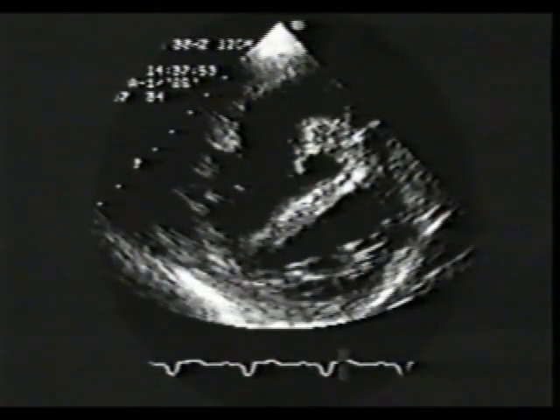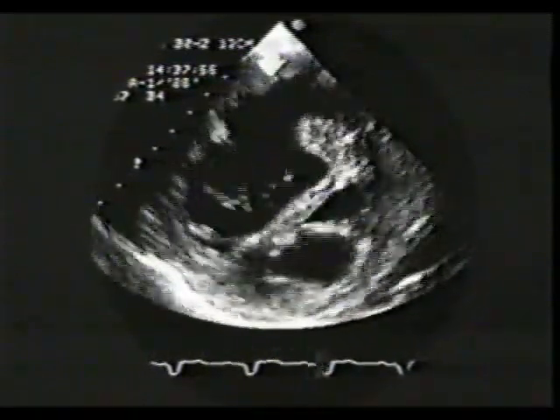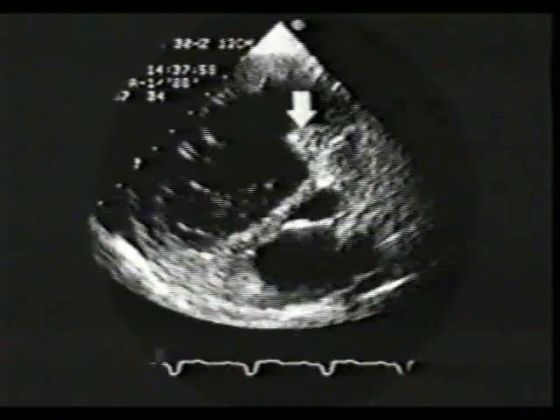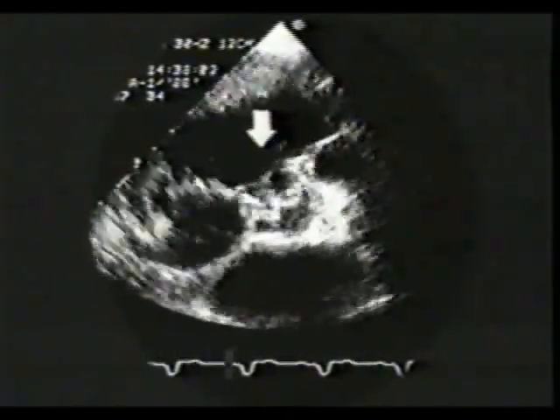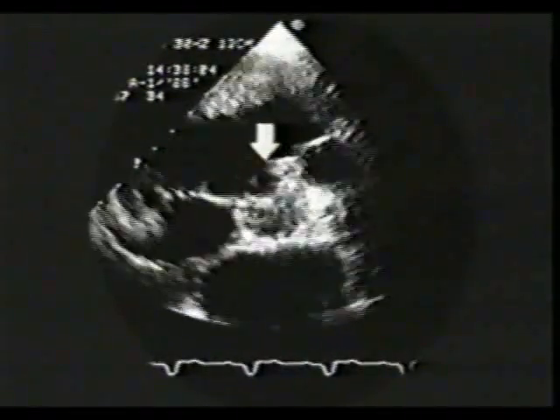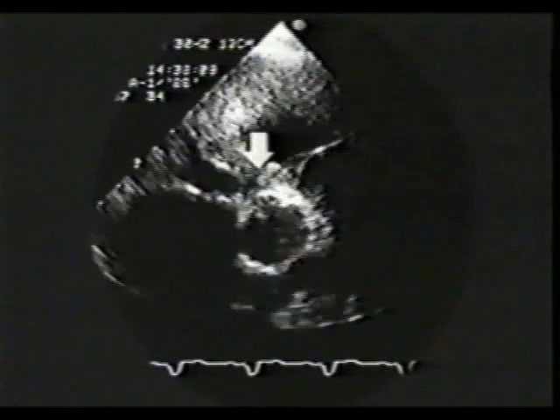This is the parasternal short axis view. Note that the ventricular septum is flattened and the left ventricular cavity has a D-shaped appearance. In real time, note again marked right ventricular free wall hypertrophy, hypertrophied trabeculum septal marginalis, and as the scan is taken to the base of the heart, large perimembranous ventricular septal defect with prolapsing of tricuspid apparatus is seen.